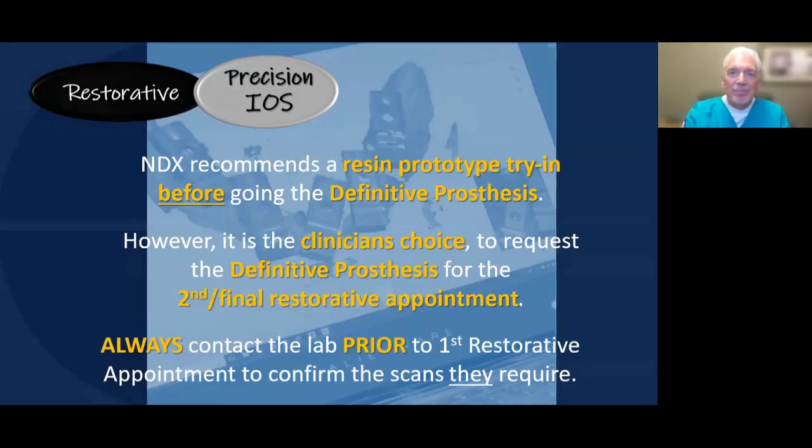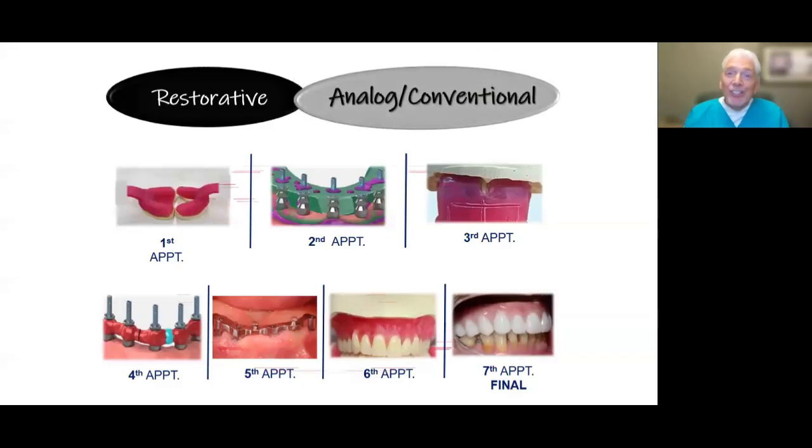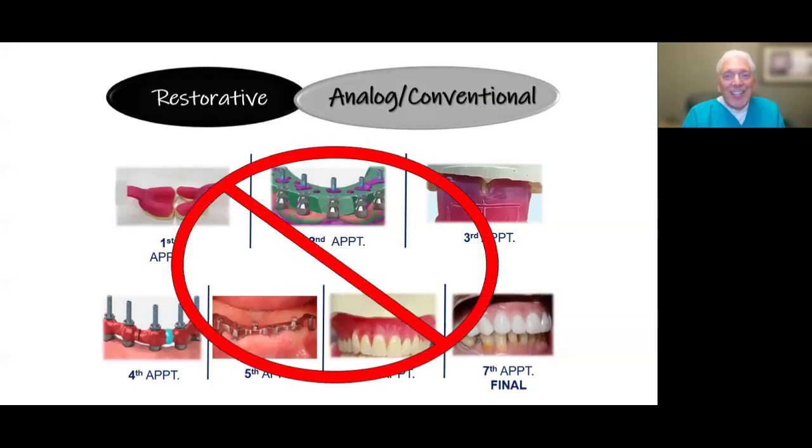The great news about digital technology, digital workflow, is we don't have to deal with all this. And those of you, hopefully some of you are nodding your head, taking your wine, toasting it, right? No more of this, of all the analog, the multiple appointments and things like that. So that's the nice thing, nice for the patients as well.